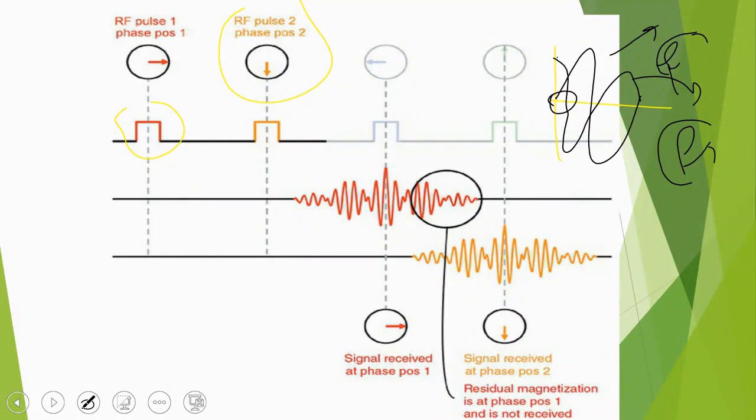So what can I do at that time? You can eliminate their signal from the image. You can remove their signal from the image because it comes in a different phase. In this case, you will only take the signal that comes from the T1 weighted image, or what is present when you acquire it. This is what I am doing.